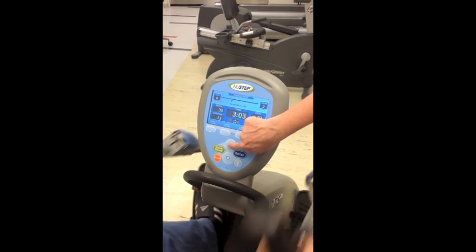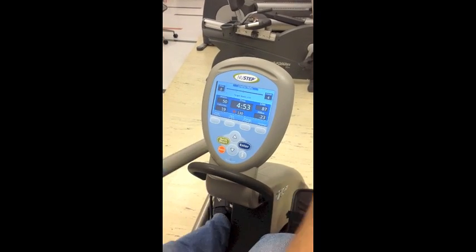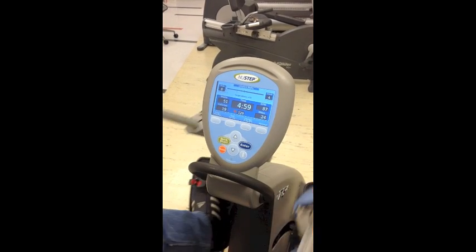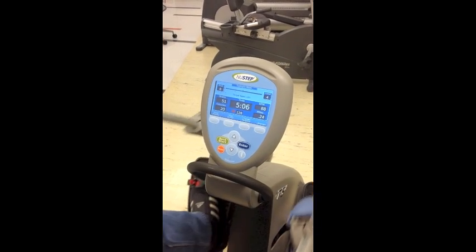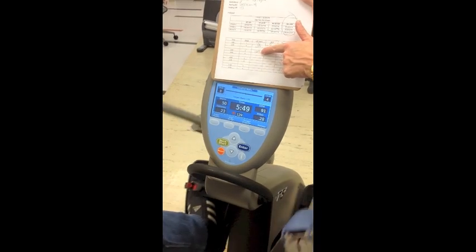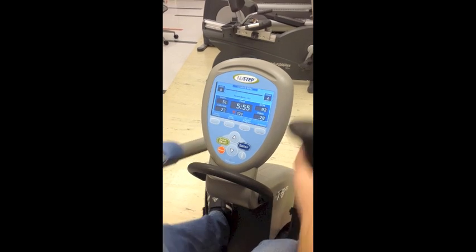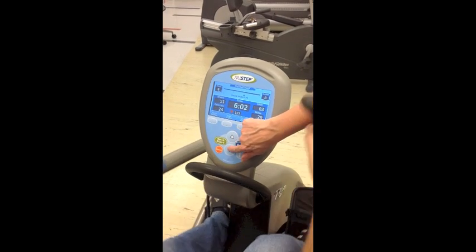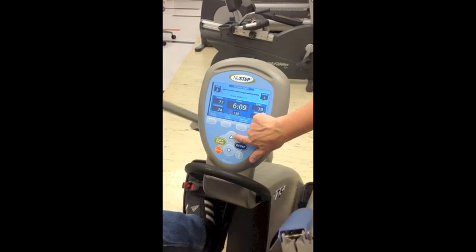This individual's heart rate shows that they are going to advance to 50 watts, so we use the up arrow and change it to 50 watts. We would have recorded the heart rate a little before minute five, and again we are going to look at that right before the sixth minute to make sure they are within five beats of each other. If they are, they get to move to the next stage; if not, they need to repeat that minute. So using the up arrow, we are now going to go to 75 watts, instructing them to keep that step rate constant.